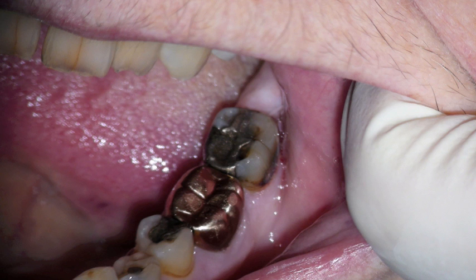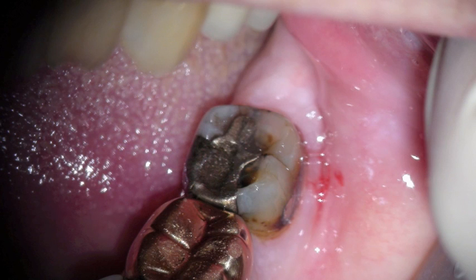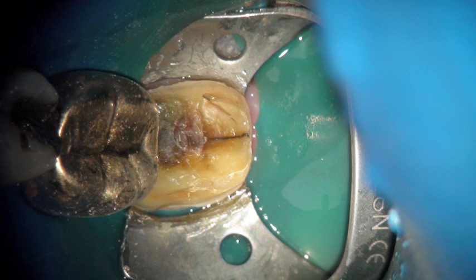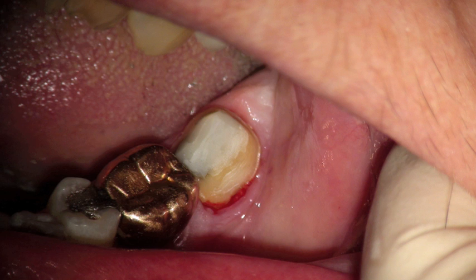In this video, you're going to see a full gold crown prep on the lower second molar. You can see at high magnification here the tooth. We're going to use a Picasso light after we prepped the tooth. You can see a crack. We did a core buildup on this tooth, and after the rubber dam was removed, you can see some bleeding that was noticeable on the buccal.